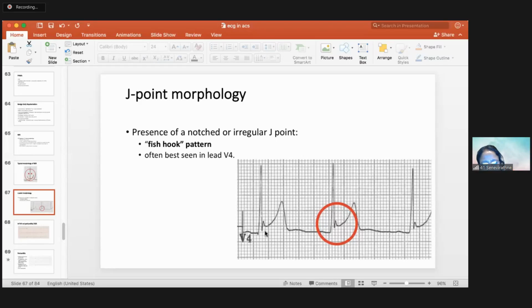Excuse me, madam. If a patient comes with an LV strain pattern, already with LV strain pattern, and with MI, how can we differentiate? It will be a bit difficult because you get downsloping ST depression and T inversions with LVH and strain. But if you have a previous ECG to compare, and there is ST segment worsening, then you can suspect acute coronary syndrome. Also, other factors like clinical presentation and troponin will help. Otherwise, there's no criteria to say.